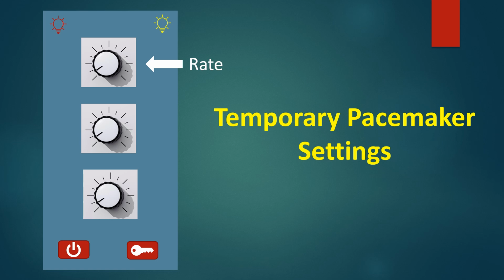For fast overdrive burst pacing, there can be an additional 2x control button. Pressing the button will quickly double the pacing rate. This is useful sometimes for overdrive pacing to break tachycardias.